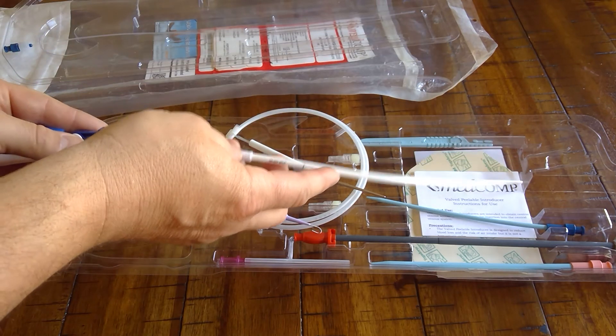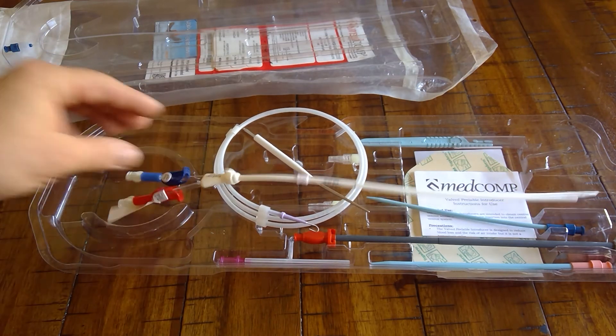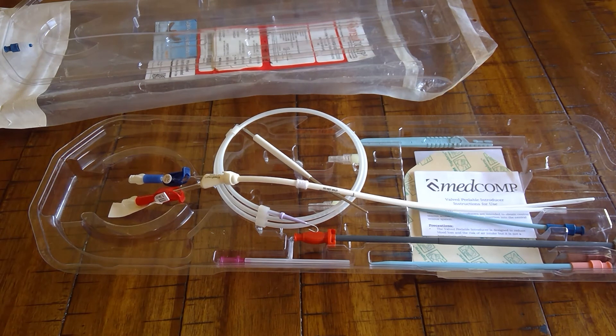Some facilities use split tips primarily, while others use step tip catheters because they're more cost-effective. If a patient returns with a poorly functioning step tip catheter, they'll perform an over-the-wire exchange for a split tip catheter. That is the split tip permanent dialysis catheter.